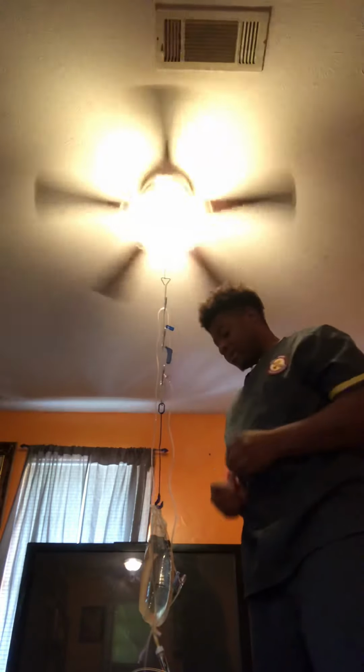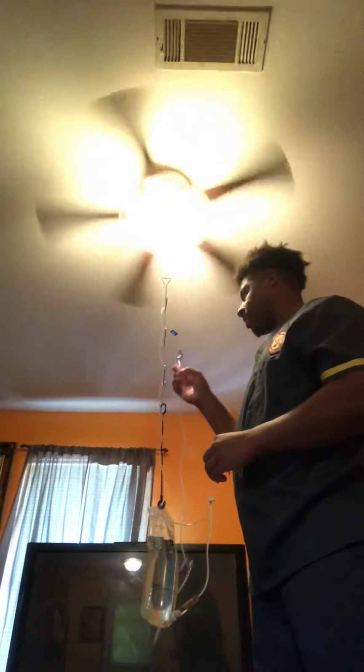Need your alcohol wipe to clean the connected part, because this has been hanging down and you just don't know what could be in it. So you want to clean this for 30 seconds to get away all debris or whatnot. So you clean that for 30 seconds. Really, after you have hung that, you want to clean that for 30 seconds.